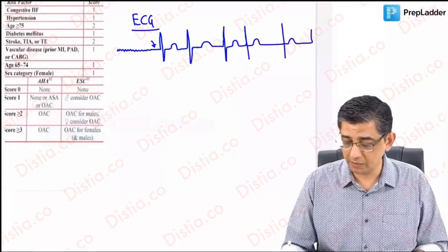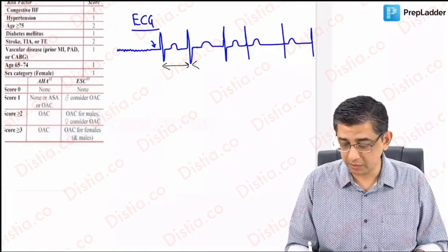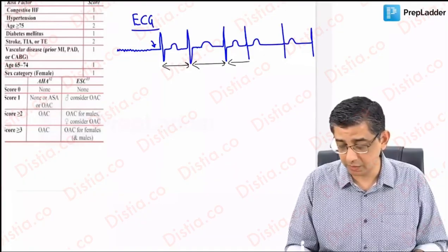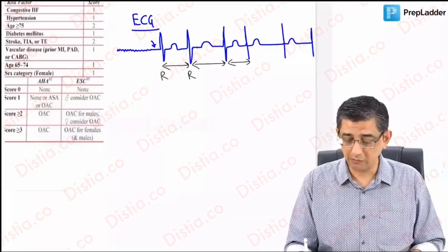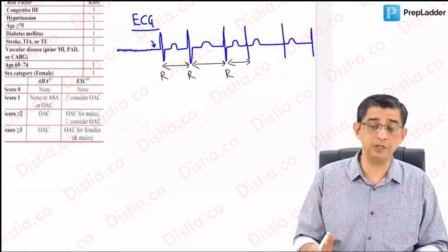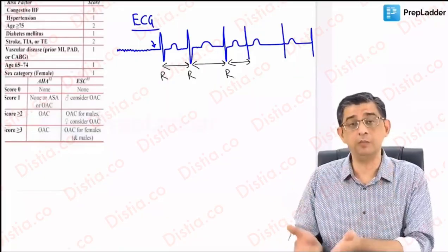And that part is, guys, that in this particular chart, the RR interval will never be constant. You see, in all tachyarrhythmias, mark my words there, in all tachyarrhythmias, the distance between the R and the R wave will always be constant. But in these patients, RR interval will keep on changing, and in between, heart rate may be normal.